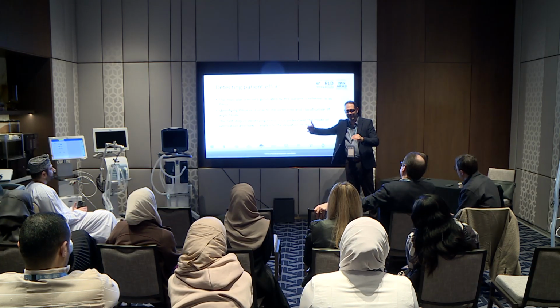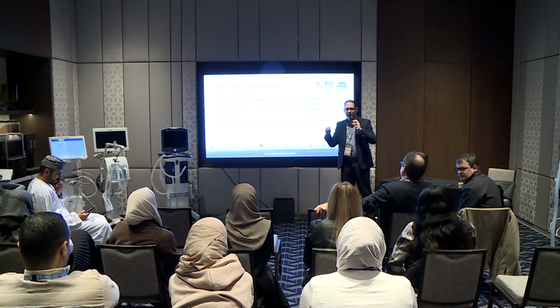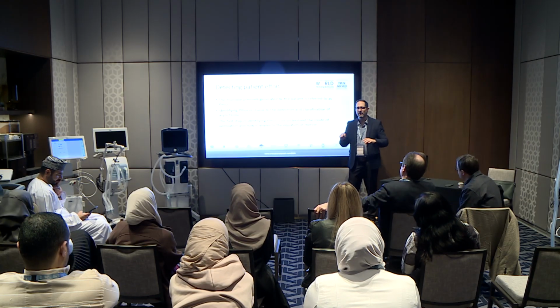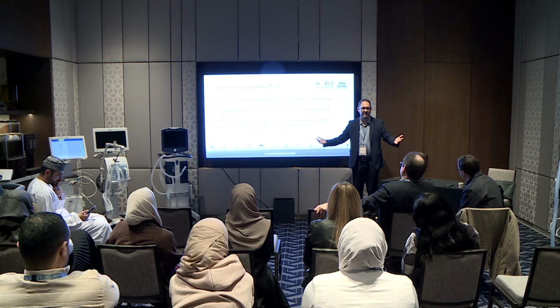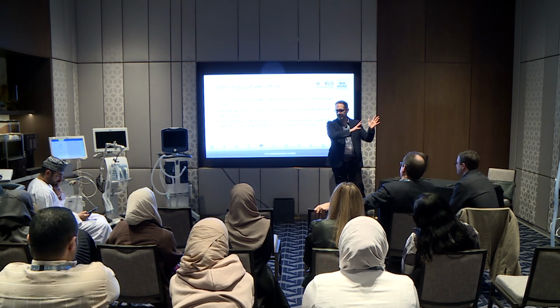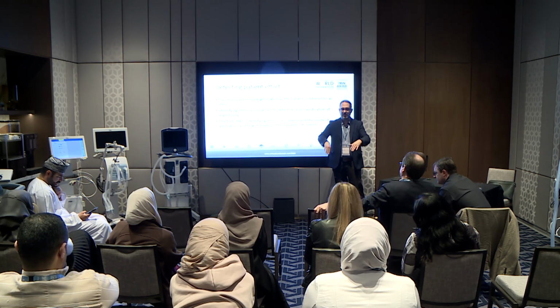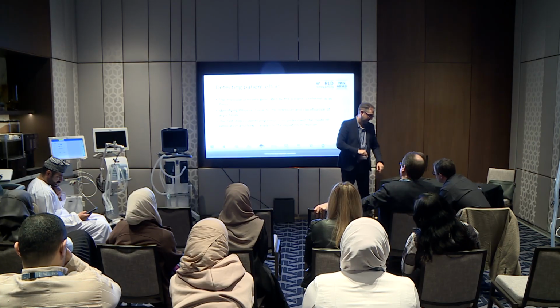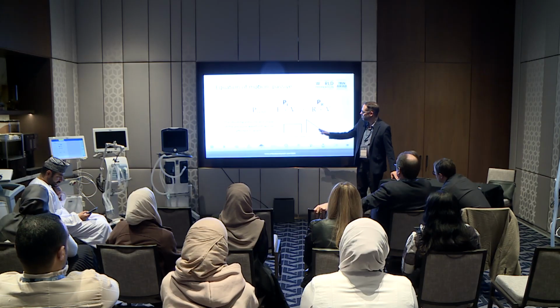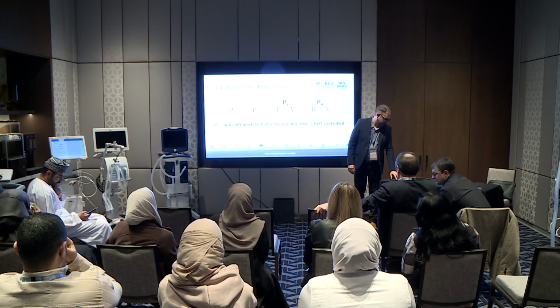Now the trigger is the same for all ventilators. You can see a little drop, but afterwards, if effort is prolonged or if it's occurring after the ventilator cycles off, you need to look for this evidence. Keep in mind that when the ventilator cycles off, every mode acts the same. It's passive exhalation. So any activity in the expiratory phase, it doesn't matter what they were on before, you should see similar patterns during exhalation because the ventilator has just cycled off. If the patient's breathing and not triggering the ventilator, you should see these patterns and they all look the same. So I don't need to review this again. In volume control, we're looking at changes in pressure. In pressure control, we're looking at changes in flow and volume.